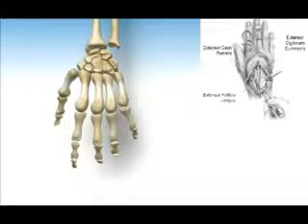sixth extensor compartment. The distal part of the retinaculum can be used to reinforce the dorsal wrist capsule. A distal-based rectangular-shaped wrist capsular flap is reflected from proximal to distal.